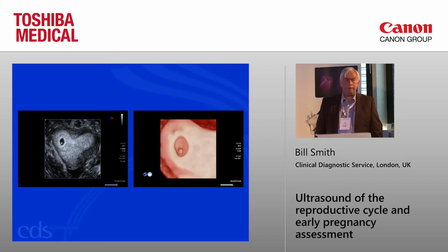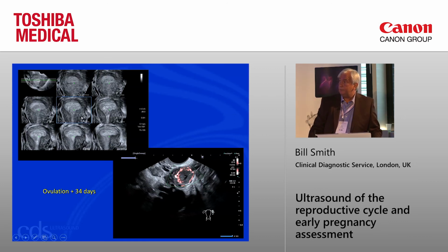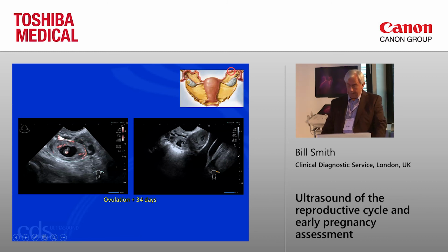And also, obviously, using 3D, we can rapidly, easily show anatomical variations. And here we're looking at a bicornuate uterus with a heart-shaped fundus. And we can see the implantation very, very clearly, our trophoblastic response, early embryo, and yolk sac. So if 3D gives us that confidence of picking up pregnancy sacs very, very early on within the uterus, then when we get this appearance, nice corpus luteum, there's our tomographic cuts, but there's no pregnancy sac there, then we know chances are we're dealing with an ectopic pregnancy. Obviously, we don't mind using color Doppler to look at the heartbeat with a live ectopic there.